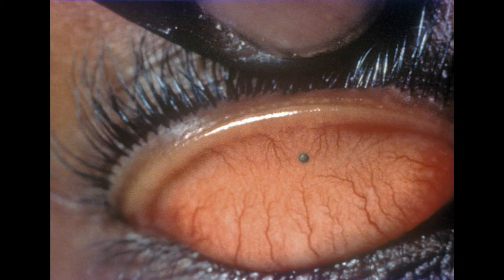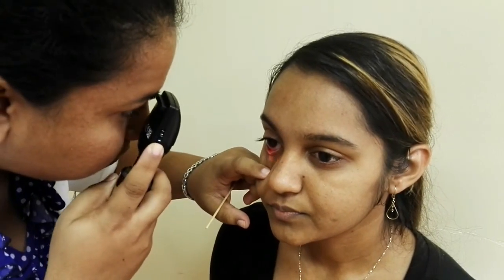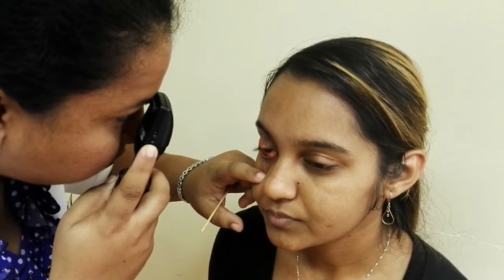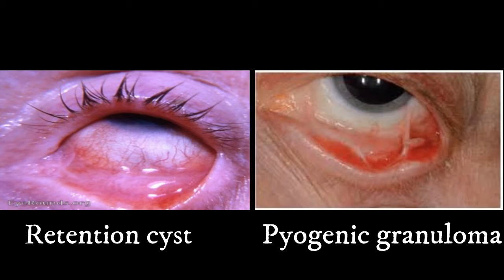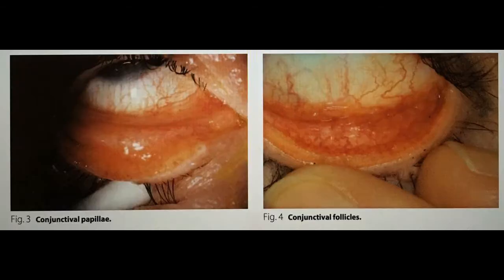Foreign bodies such as a speck of dirt or metal can be visualized and accessed in this area. The lower lid is retracted by gently pulling down the skin with the thumb or forefinger, exposing the inner palpebral conjunctiva. The patient is instructed to look up while the lower lid is held, and the plus 10 setting on the direct ophthalmoscope is used. Inspect for redness, swelling, roughness, and concretions, some of which can be seen in conditions such as pyogenic granulomas and retention cysts. The lower fornix may also demonstrate elevations in the form of follicles or papillae, which can be a feature of viral or chlamydial conjunctivitis.